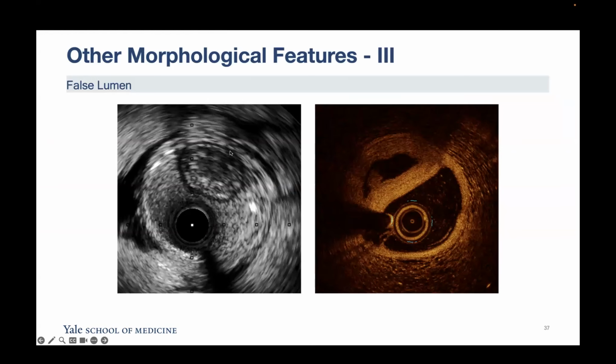Other morphology. So I just brought these two images because we had a recent case in the cath lab. So I think it's nice for us to recognize. This is one CTO that I did many years ago. I thought that I was intraluminal when I checked with the retrograde injection, but I wasn't sure. So I decided to go down with the IVUS catheter, and I made sure.